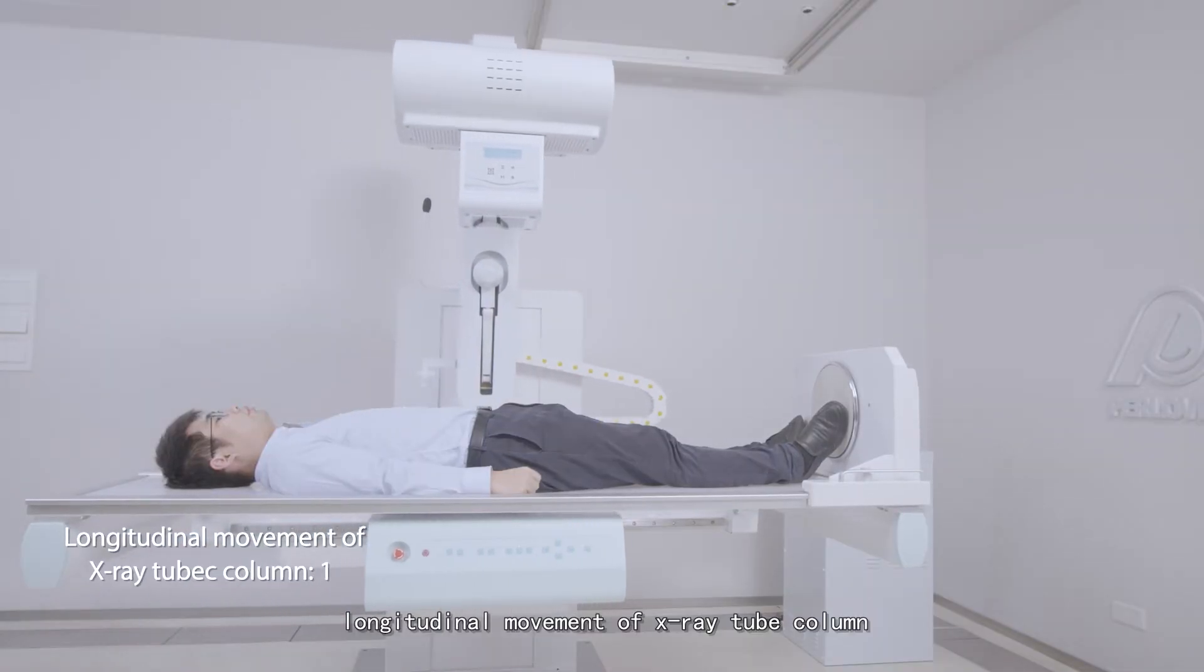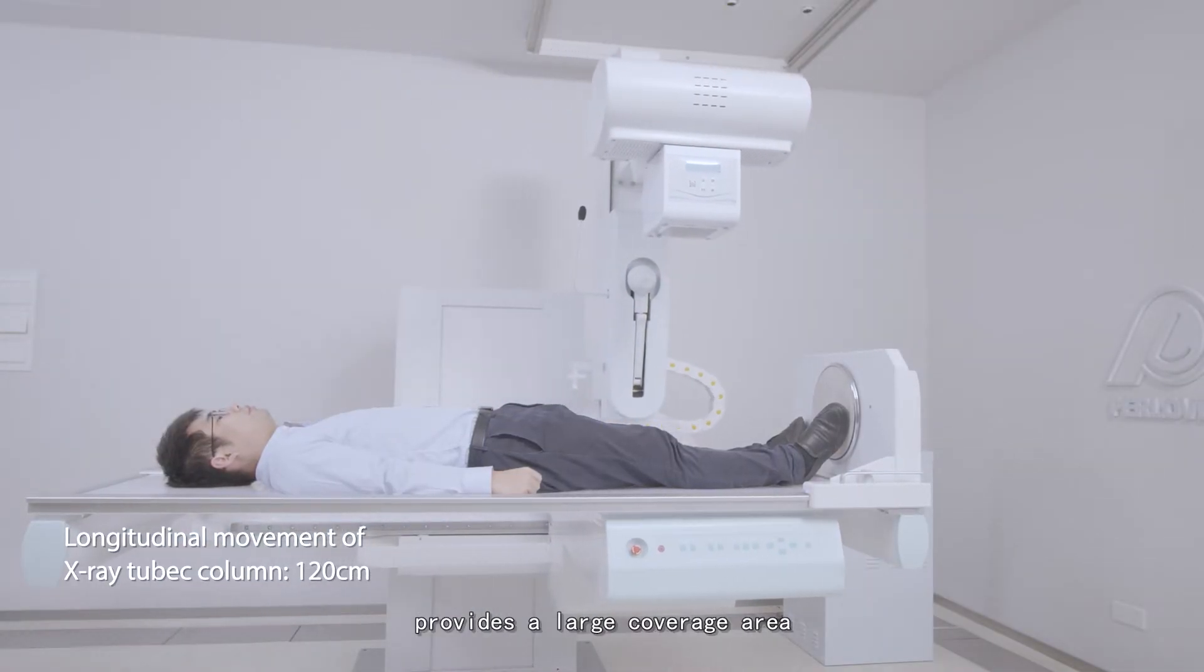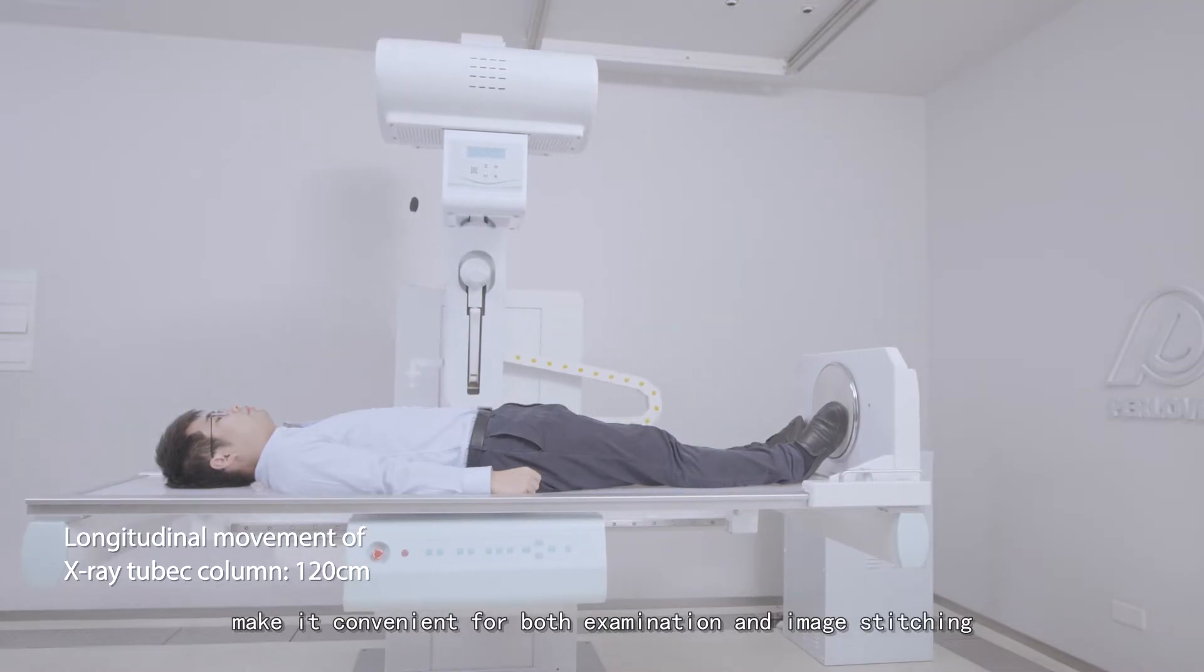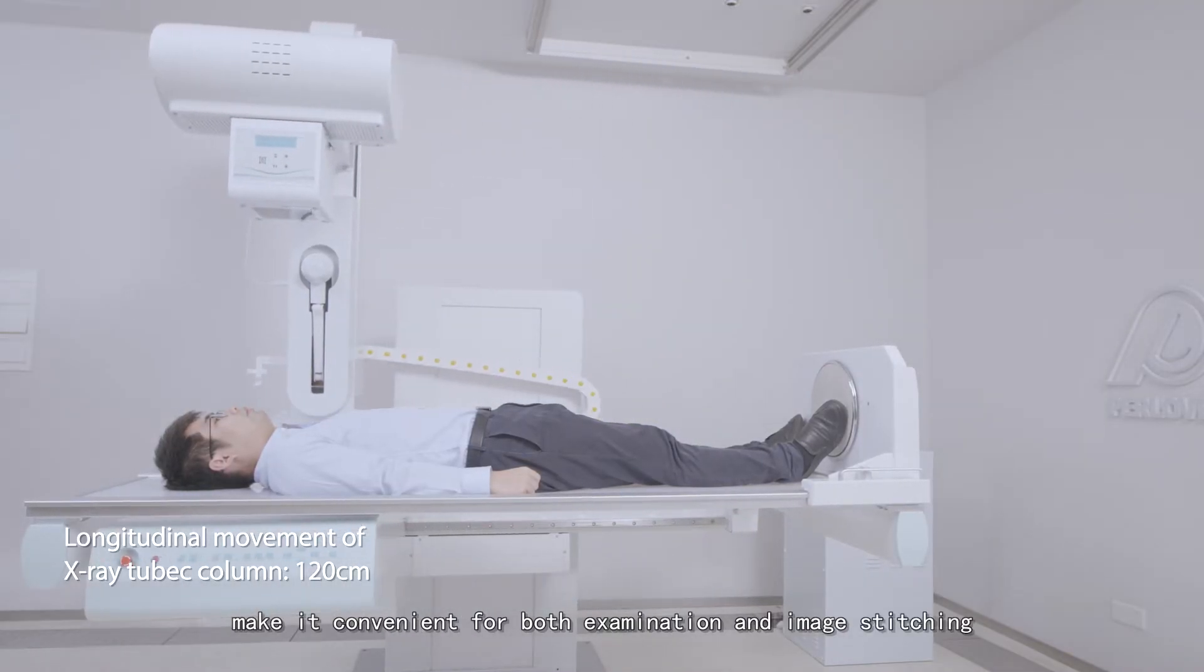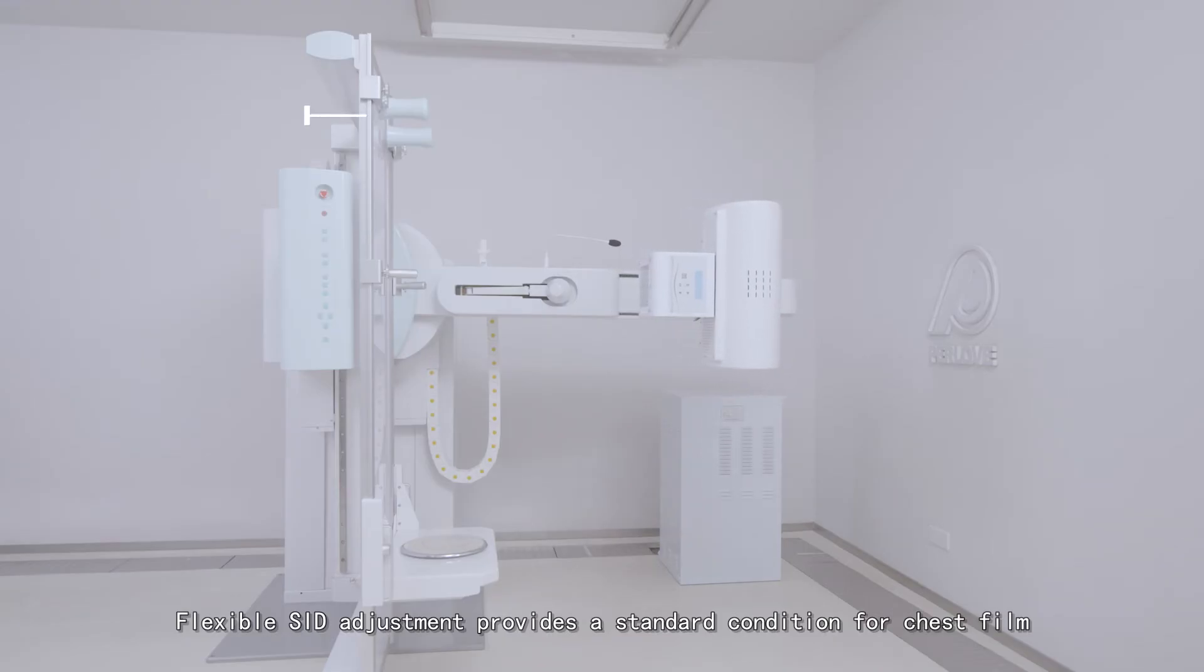Longitudinal movement of the X-ray tube column provides a large coverage area, making it convenient for both examination and image stitching. Flexible SID adjustment provides standard conditions for chest film.